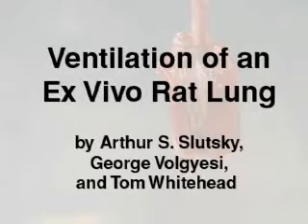This video shows an isolated rat lung that is being ventilated with volume control ventilation at two different levels of PEEP. The key points to look for in this short video are the marked heterogeneity of expansion of the lung, the time required for recruitment of the lung, and the need for a sufficient PEEP level to maintain the lung recruited. Note that because there is no chest wall in this model, the lung collapses entirely at the end of expiration during no pressure, which is not the case in vivo.